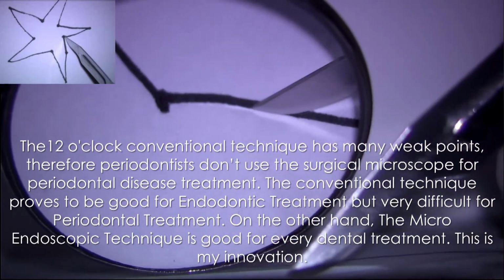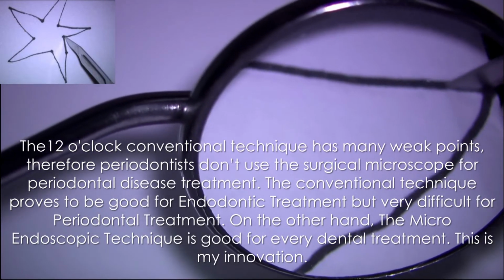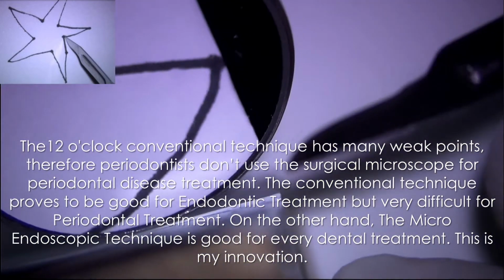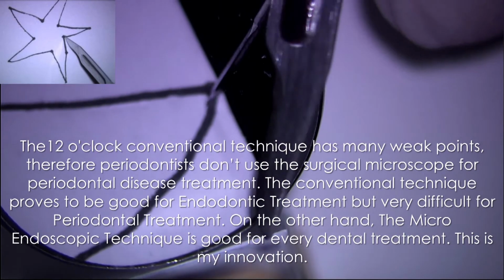This dentist's mirror technique skill is excellent, as you can see, but the field of view is very narrow, it is very difficult to focus, and a one-handed incision is very dangerous, I thought.